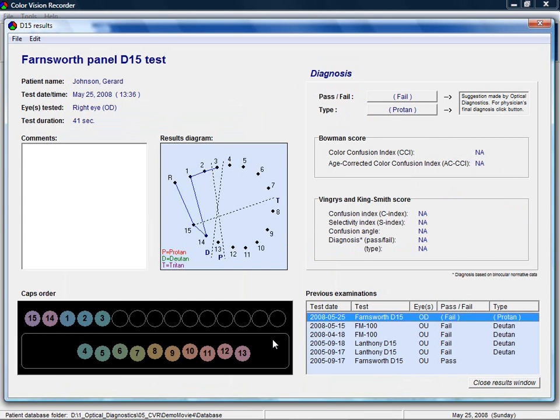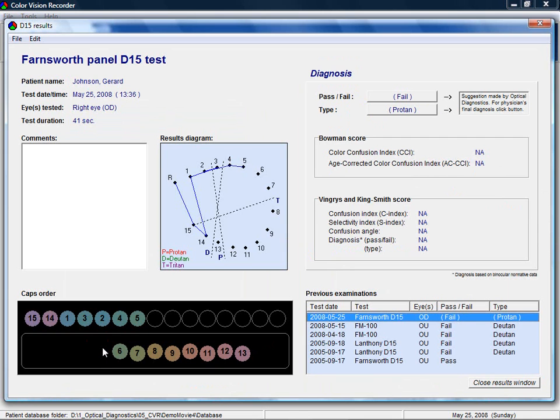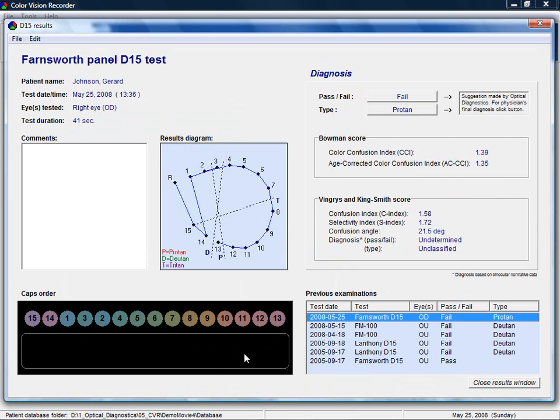In the results window, you can still change the cap order. Holding down the right mouse button and moving over the cap is the same as clicking on the cap. This may be used to speed up entering external data of normal or near normal subjects.